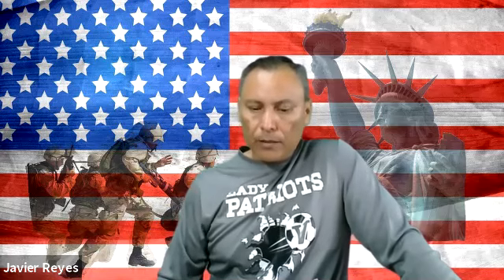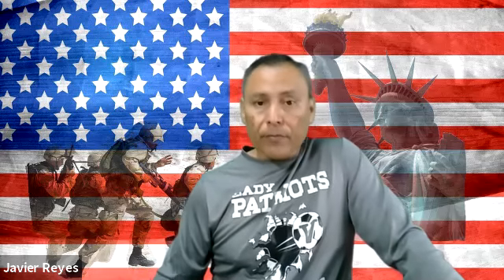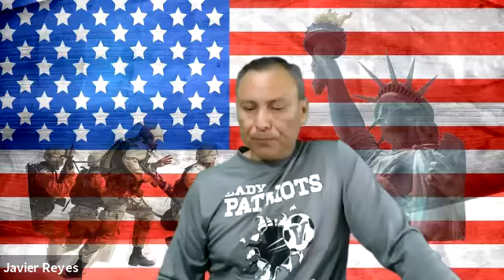So those are some of the time limits, as a general rule. What is the time limit to separate the cells? 2 hours is correct. Very good. Now there are a few exceptions. You don't have to wait 2 hours all the time. If you can bring them in 30 minutes, an hour, it's fine, as long as you bring them to the lab within the 2 hours.